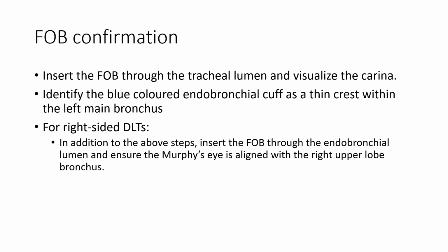So now I'm going to talk about fiber optic bronchoscope confirmation. Traditionally, studies have shown that 24 to 39%, about 40%, of blind insertions of a left double lumen tube without fiber optic confirmation will result in endobronchial intubation of the right main stem bronchus. So the misplacement of a double lumen tube is actually common if we don't confirm with the fiber optic bronchoscope.